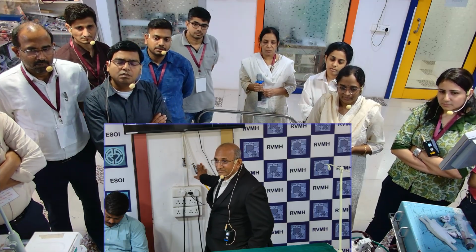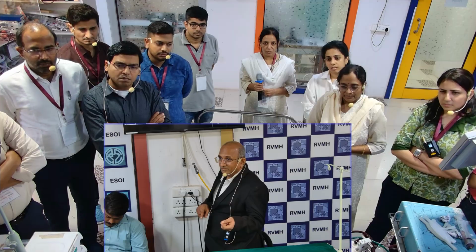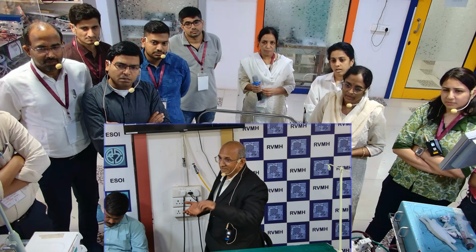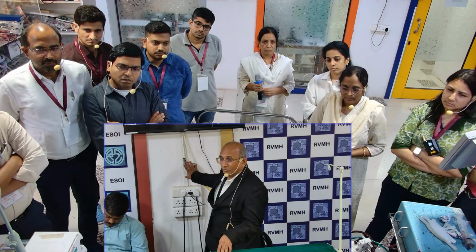It's a reverse condition. So when you keep FiO2 at 100, FiO2 is 21. It will be 21 only. And when you keep FiO2 at 21, it will be 100. So again it will behave as a sweep gas failure. Am I right? So these are two possibilities at the source.